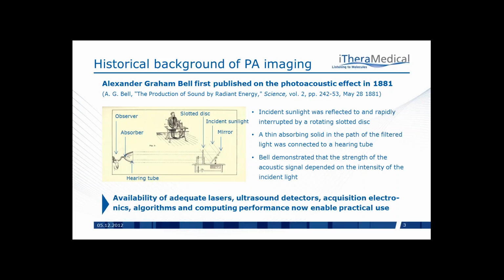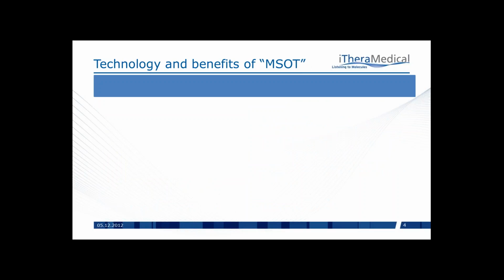But it was not until about 100 years later that adequate lasers, very sensitive ultrasound detectors, and suitable data acquisition electronics, in addition to sophisticated algorithms, really allowed this physical phenomenon to be translated into a viable imaging modality.